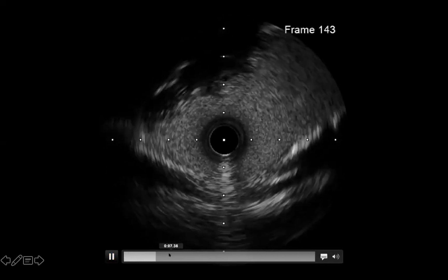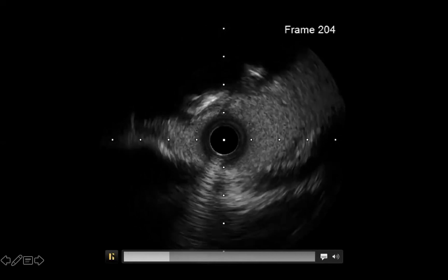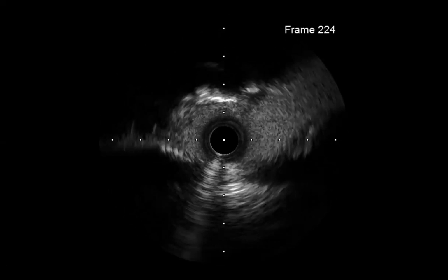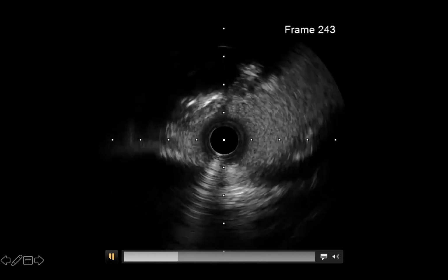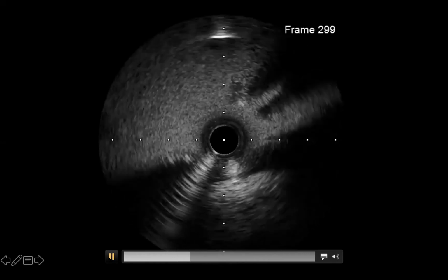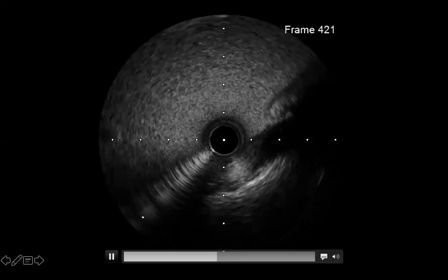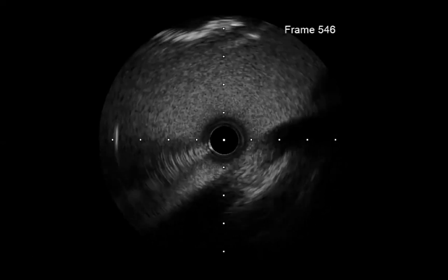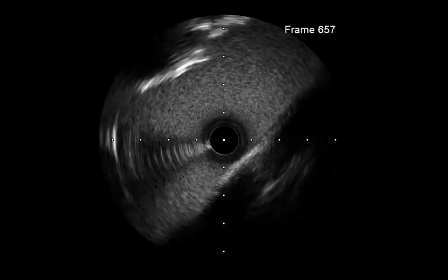But I think there is disease, there is a plaque. He's showing the frame, although we can't see the whole circumference. There is disease, whether it's critical or not, it's difficult to say. We should have a very good frame where you can see the whole circumference and then you can measure the diameter.